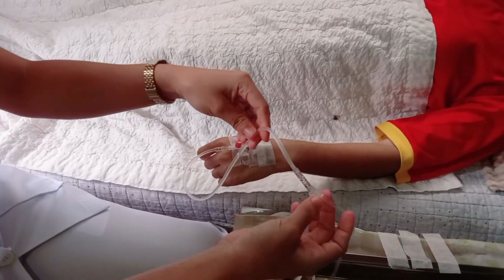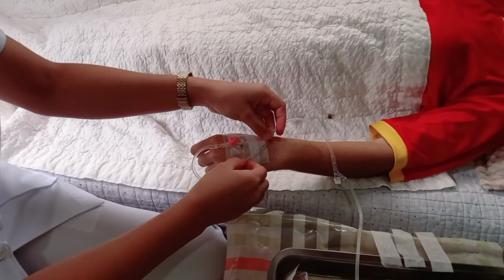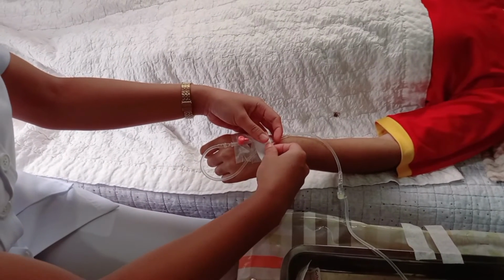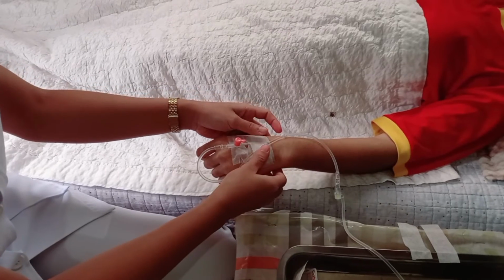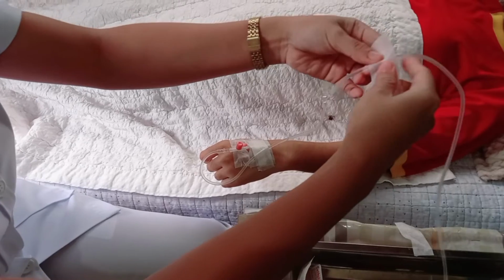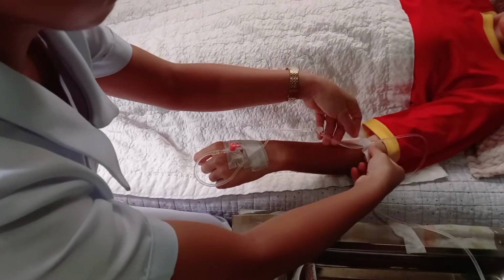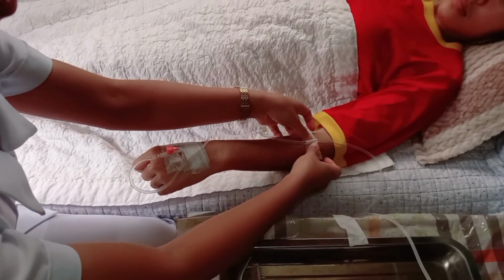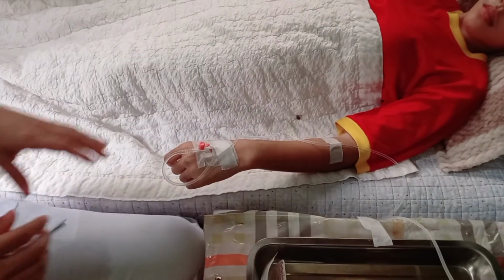And loop the tubings near the site to prevent the movement of the tubings, which would cause the needle to be removed. So we will anchor the arm of the patient to an arm board if necessary. This is especially for pediatric patients, to protect the arm against change in position.